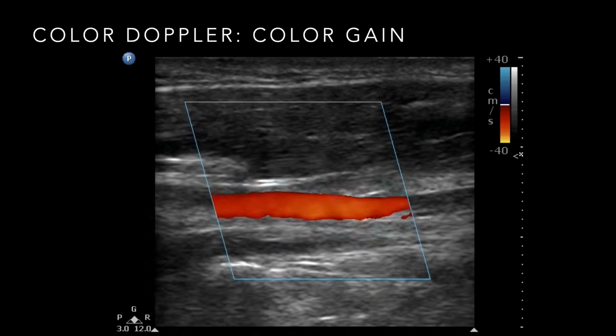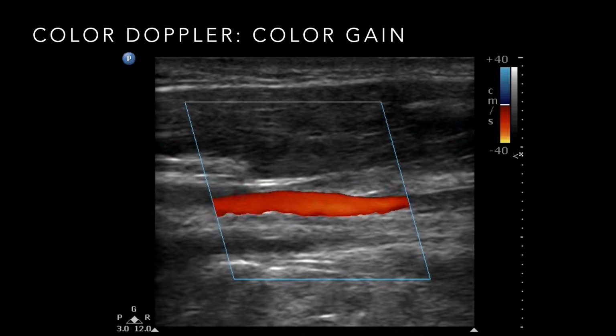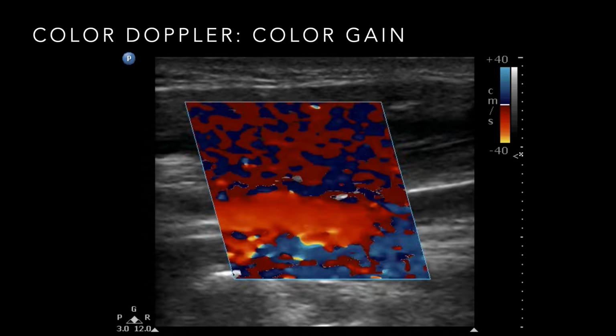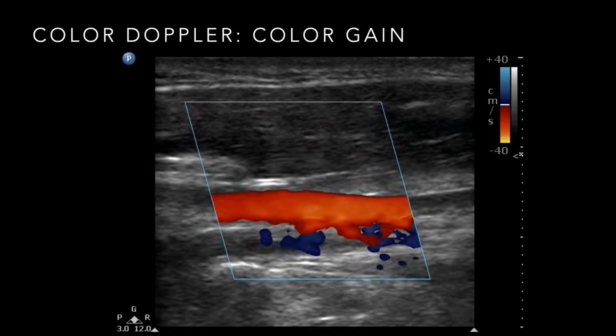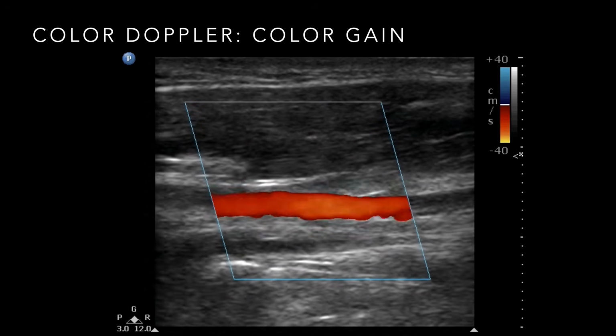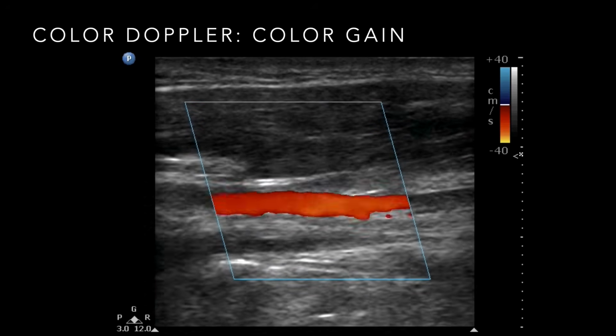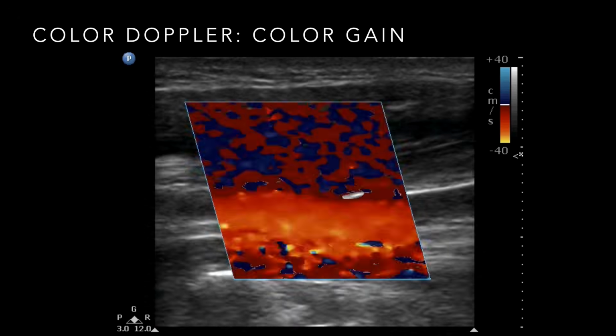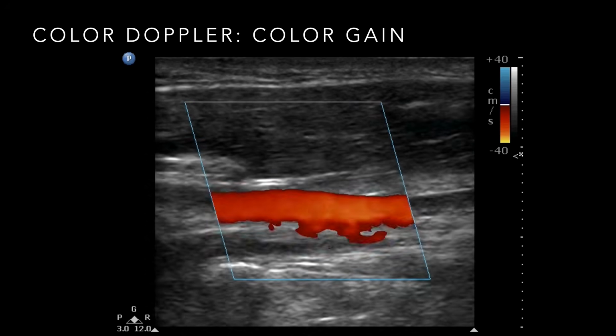I mean, we did talk louder when my grandpa couldn't hear very well, but he has his hearing aid and he can turn that up and adjust the sensitivity of that microphone in the speaker that's in his hearing aid so he can hear the sounds better, right? And so on ultrasound, as we turn that gain up, things get brighter, right? We can see things better. It may get noisier because now we're listening to a whole bunch of sounds.